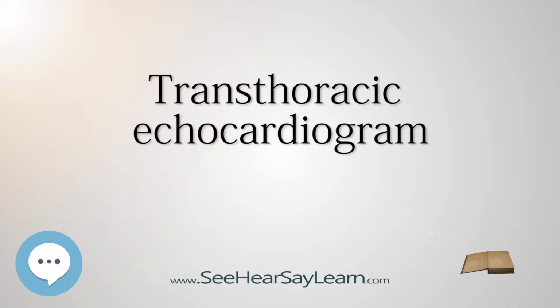It is used as a non-invasive assessment of the overall health of the heart, including a patient's heart valves and degree of heart muscle contraction, an indicator of the ejection fraction. The images are displayed on a monitor for real-time viewing and then recorded.